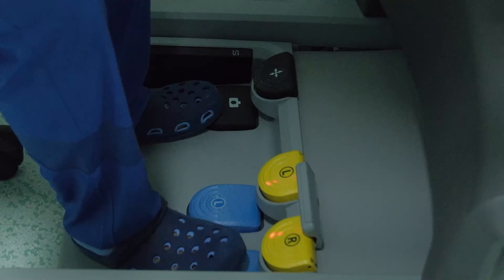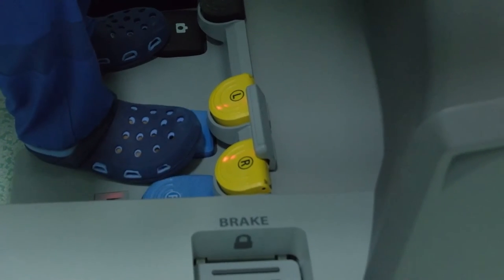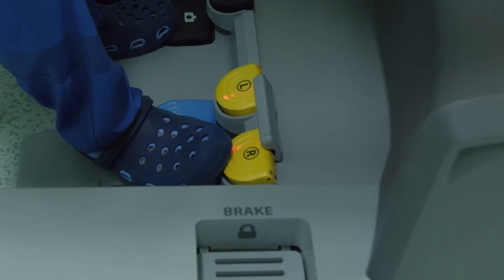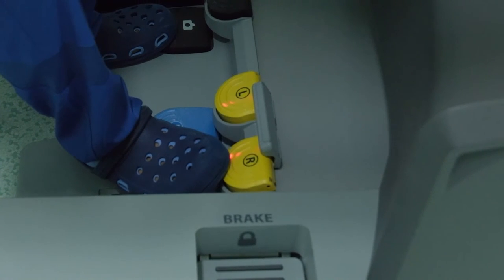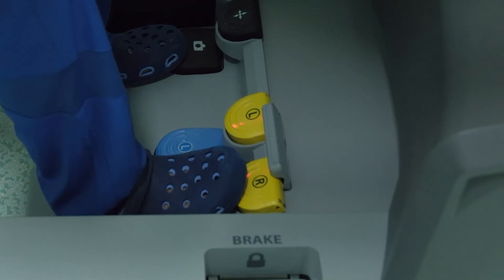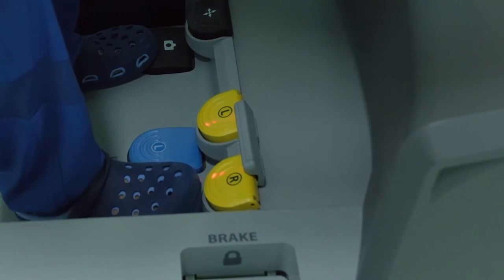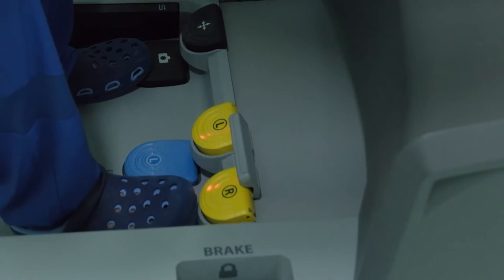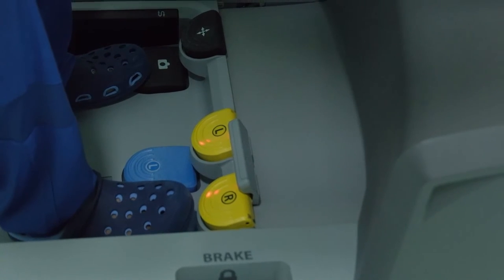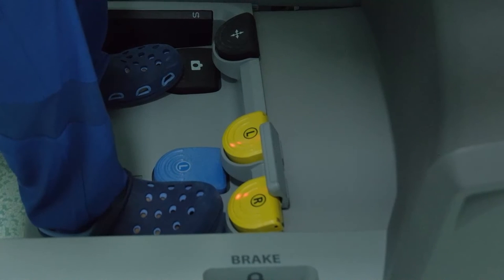Also using these diathermy pedals, we can actually do a monopolar or a bipolar cautery from our right or left foot. Also, the vessel sealer and the harmonic function is used using the same energy pedals. One of the beauties is that as soon as you put your foot here, your foot is detected and you get a separate light on the console which shows that your foot is above the energy pedal and you are going to press it. Once you press it, the light changes to yellow and that shows that the energy is activated. So, even before you activate the energy pedal, you know that your foot is above it.